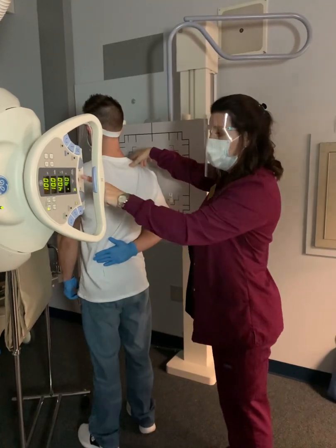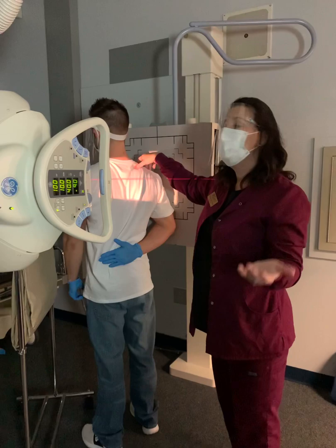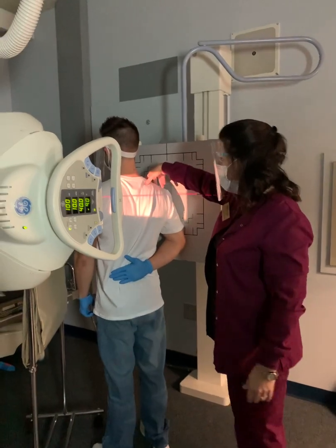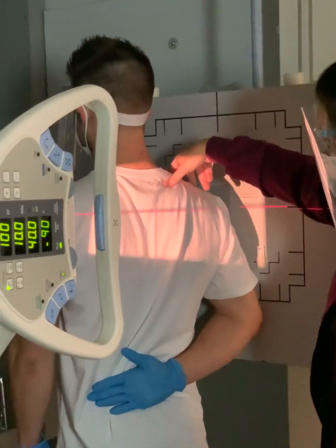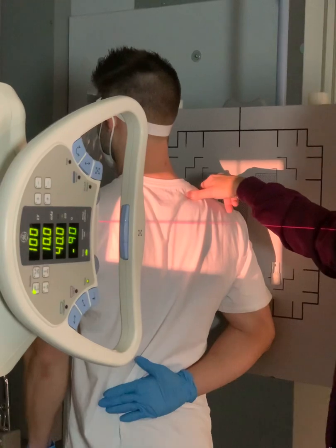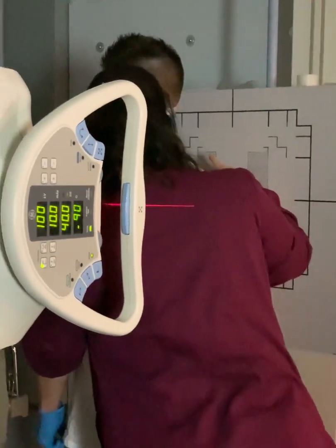This is very easy to palpate. Superior angle here. AC joint. The AC joint is the acromial tip, y'all. The acromial tip meets at the AC joint. So those are the same two things. You've got to make an invisible line from the superior angle to the AC joint, and that line has to be perpendicular to the center of your IR. Okay? So I'm going to line those up.